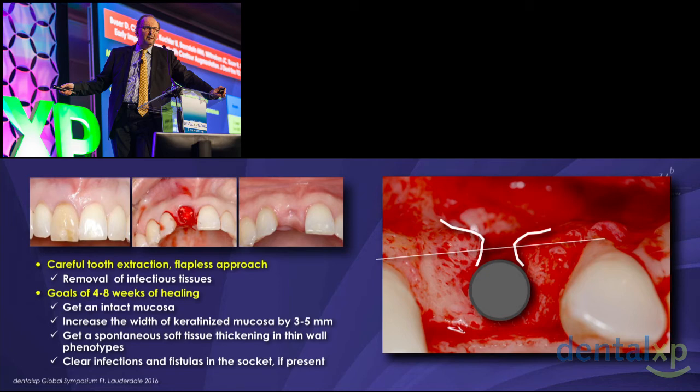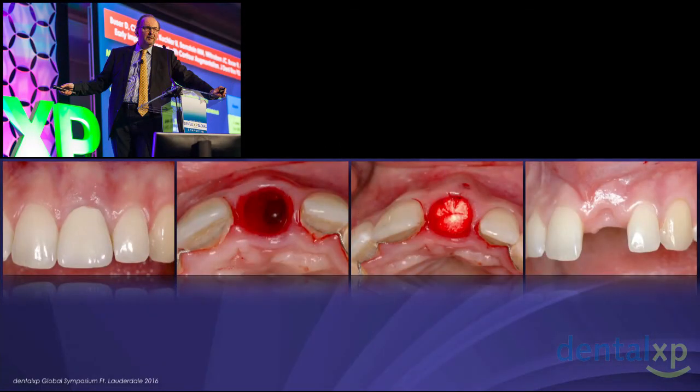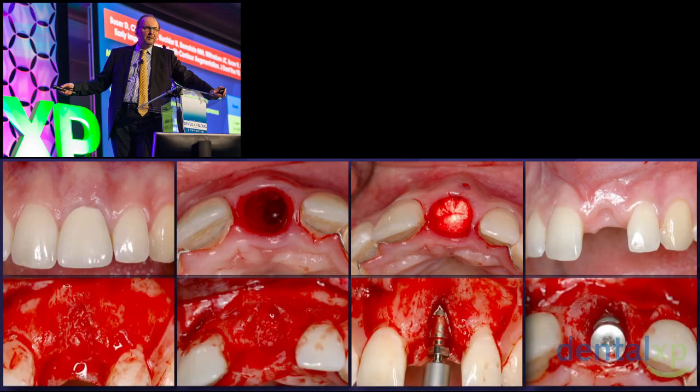I will explain that this afternoon because this is the best precondition for successful bone augmentation or regeneration of that bone. You need to give the right fillers to speed that up, and then you get an absolutely predictable treatment outcome, or regenerative outcome. So here is one case that was in that paper. You see this is the extraction, you see a lack of keratinized mucosa. 8 weeks later, everything has healed, and now you have here 5 millimeters additional keratinization. And then flap elevation, correct 3D position of the implant, two-wall defect, the implant surface slightly inside the point of emergence, about 1 millimeter, 1.5.